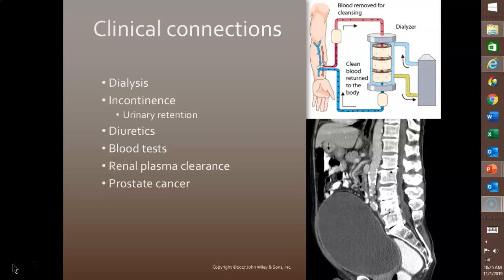So a catheter is going to be inserted into the peritoneal cavity and connected to a bag of the dialysate. Same thing that we saw with the hemodialysis. So the fluid is then going to flow into the peritoneal cavity by gravity. It's left there for a little bit of time so that it permits waste products and excess electrolytes to diffuse from the blood into the dialysate. And then the dialysate is going to be drained out of the body into a bag and discarded and replaced with fresh dialysate.